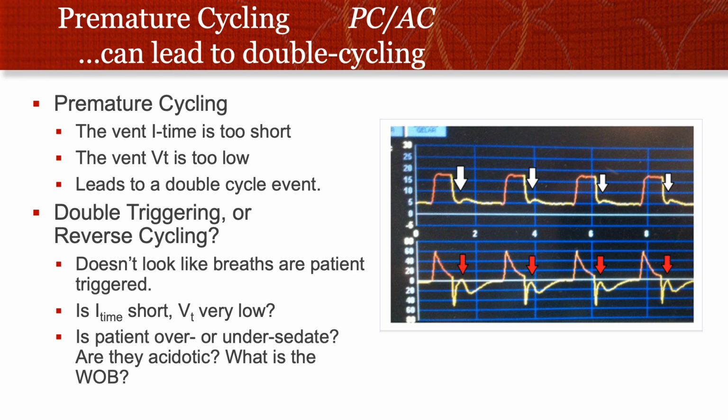But I would look at the patient and make a decision on whether they are riding the ventilator over-sedated, or whether they're working hard to breathe with acidosis and trying to get bigger breaths and raise their own minute ventilation. If they're trying to get bigger breaths and raise their minute ventilation and trigger as frequently as they can, this would be likely to be a double triggering event.